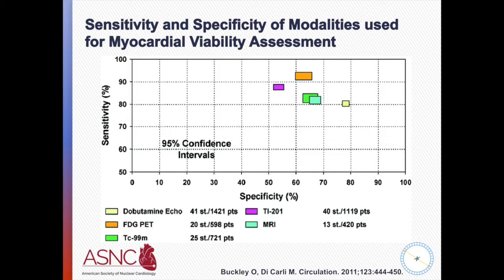So your thought process is that the metabolic study is really an excellent comparison with a perfusion study, regardless of which it is. Right. Most people would use rubidium. So there's some real advantages to doing an FDG metabolic study. Yeah, that's my impression for sure. And what were the results in this particular patient?